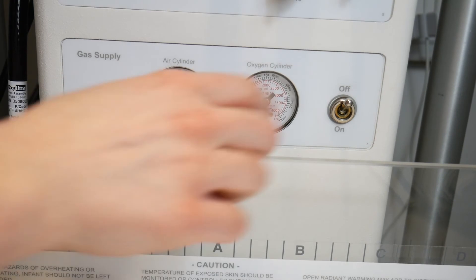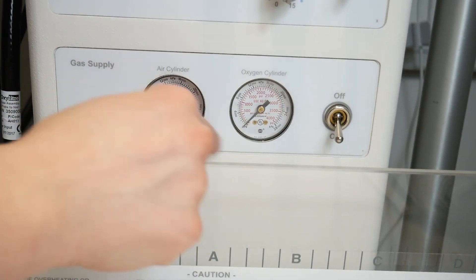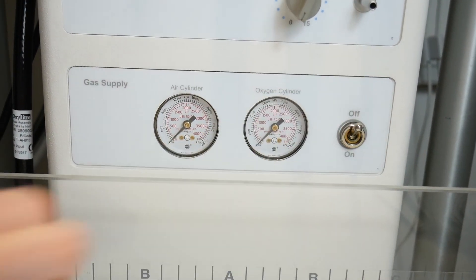These dials show how much air and oxygen are in the tanks behind the resuscitaire, and this switch should be used whenever the gases are in use.